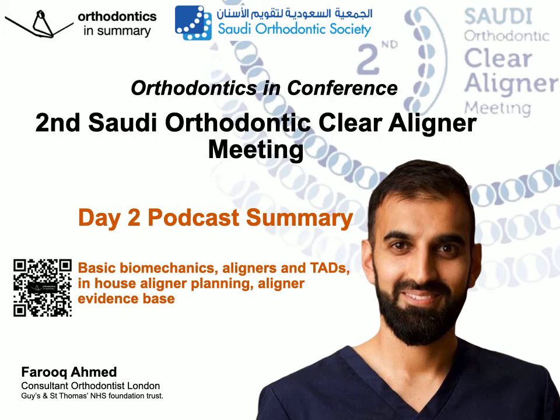He spoke about how molar anchorage loss in first premolar extraction cases is greater than is usually planned on ClinChecks, of 2 to 3 millimeters. We tend to also get mesial tipping of the upper first molars of 5 degrees. We get reduced retraction of the upper incisors, only usually around 2 millimeters, and also there's retroclination of the upper incisors greater than what we'd expect of 5 degrees. This was Dye's paper in 2019.